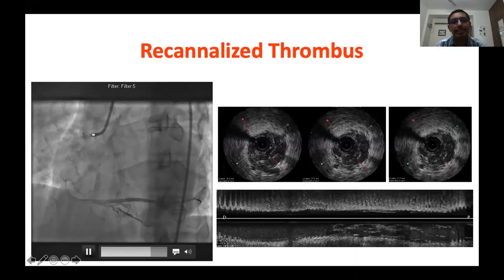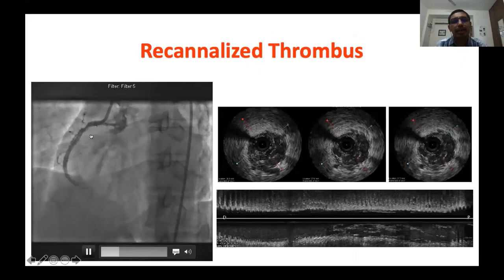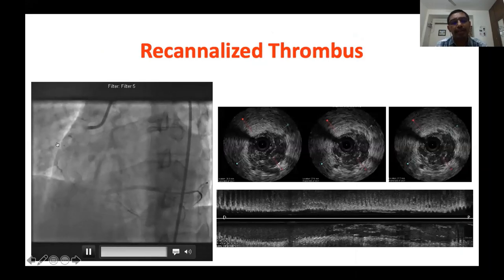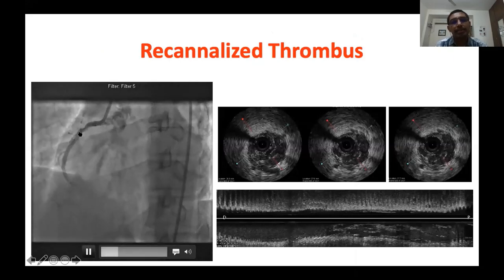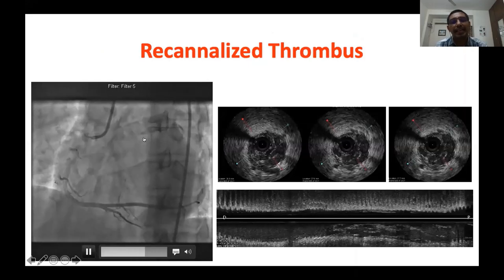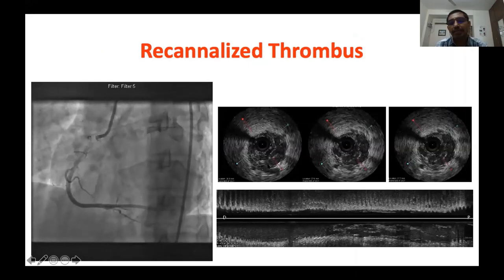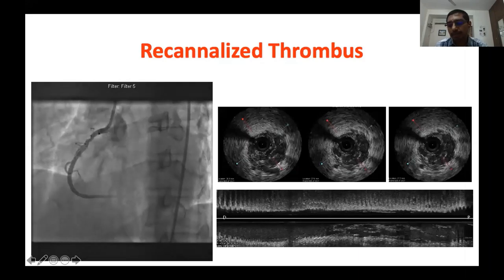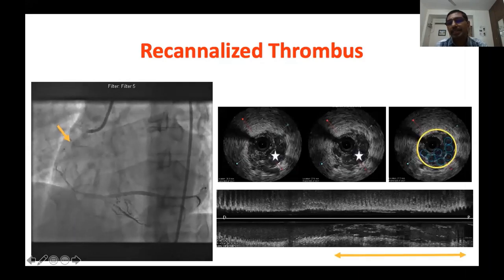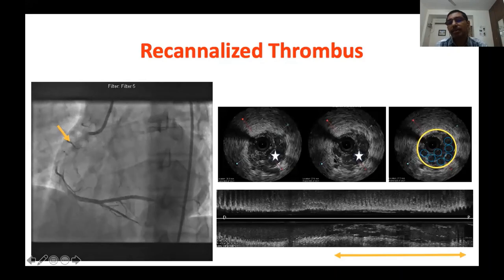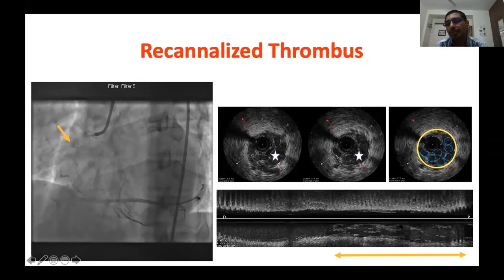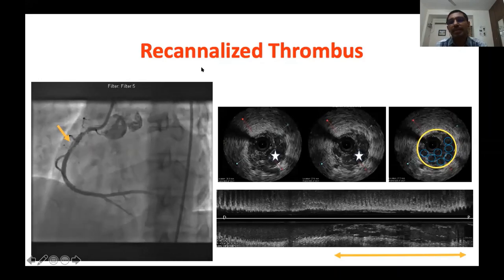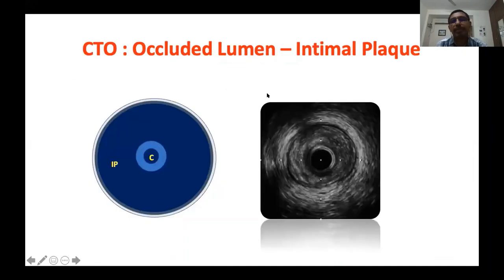Here you can see an angiogram showing multiple flap-like appearances — we used to call this spontaneous coronary dissection, but with IVUS and OCT imaging we now know that most of these are recanalized thrombi. A recanalized thrombus is an intraluminal mass with multiple channels — typically called a lotus root or Swiss cheese appearance. Here is the longitudinal view showing multiple channels — the typical appearance of recanalized thrombus.